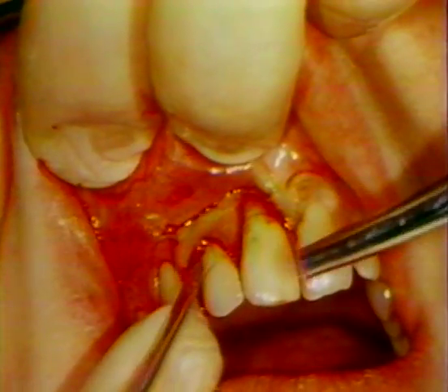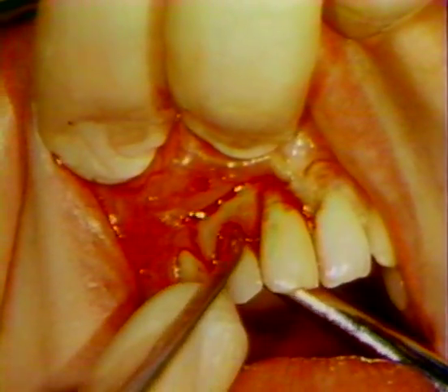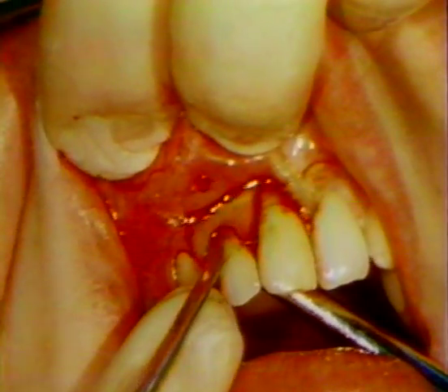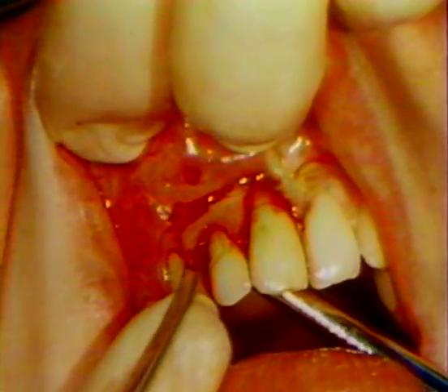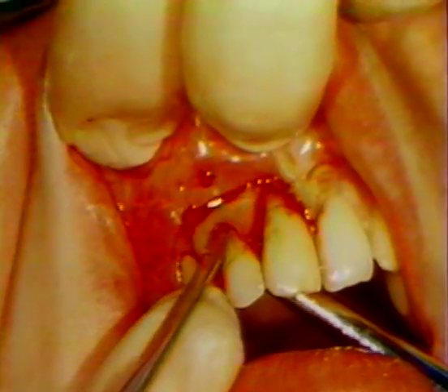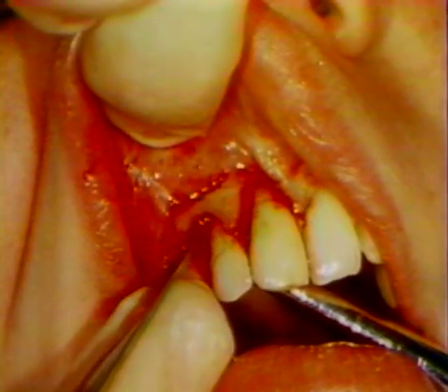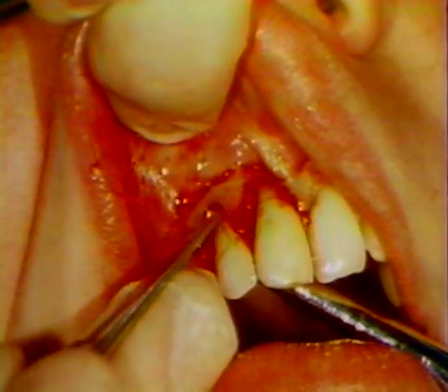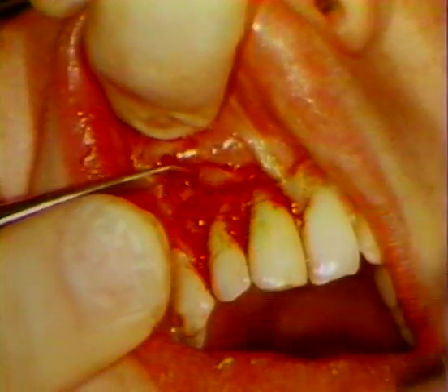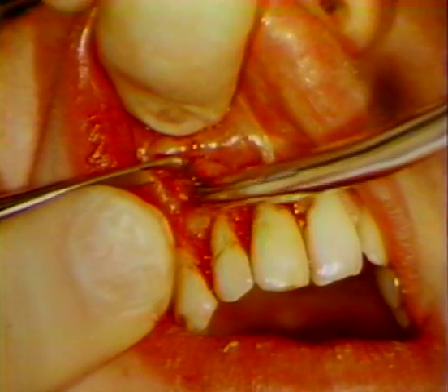The mucoperiosteal flap is raised with a plastic instrument used as a mucoperiosteal elevator. The tissue should be handled carefully in order to avoid any crushing or tearing effect which would interfere with the blood supply.